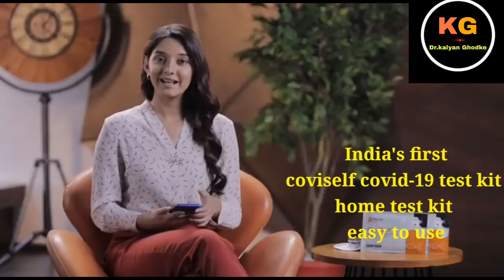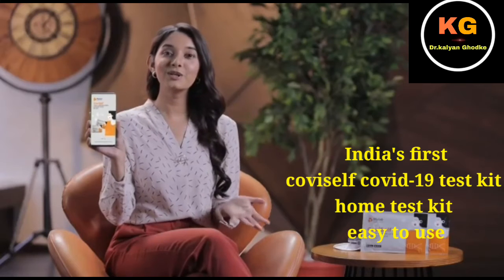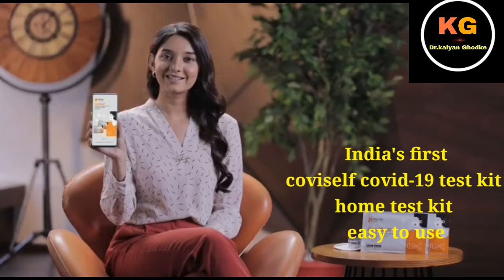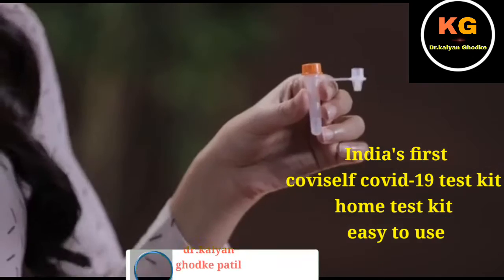Before you proceed with the test, please download the MyLab Coviself app either on Google Play or App Store. Fill in the credentials and then proceed with your test. The test preparations are now complete. Let's begin with the test.